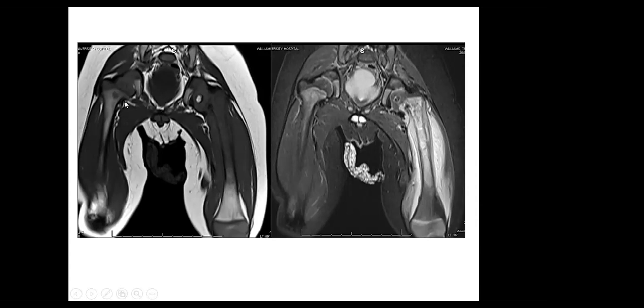So I think in the bone tumor talk, we said if there is an aggressive primary bone tumor, we would recommend bone scan and CT scan of the chest. Okay, so we're done with this case. Let's move on. Do we have another resident?